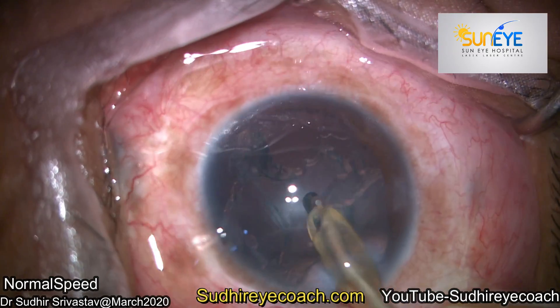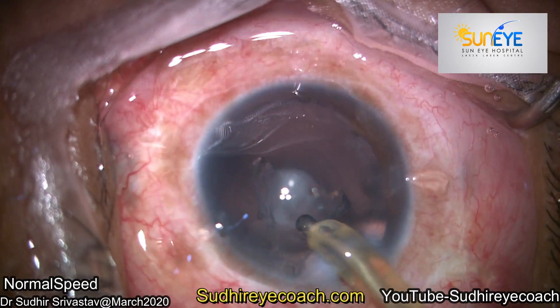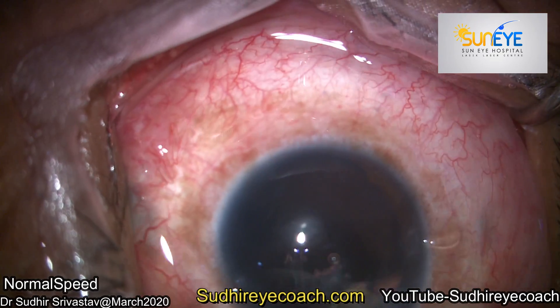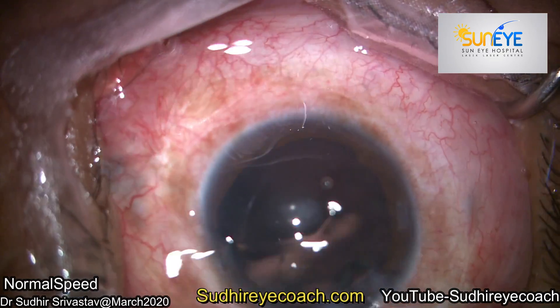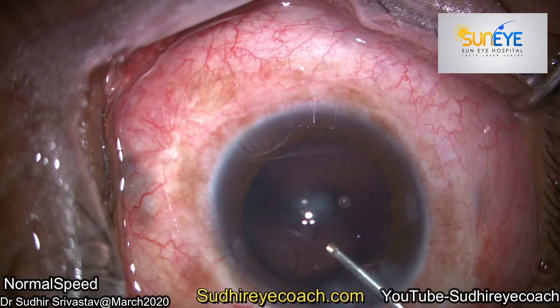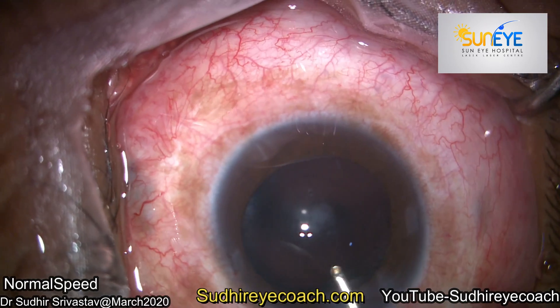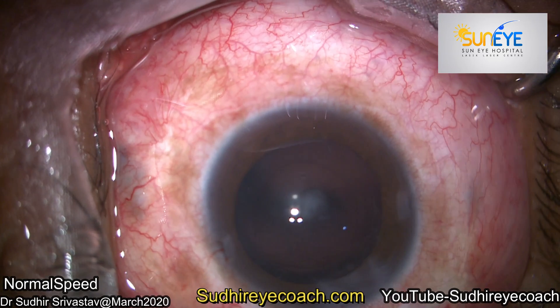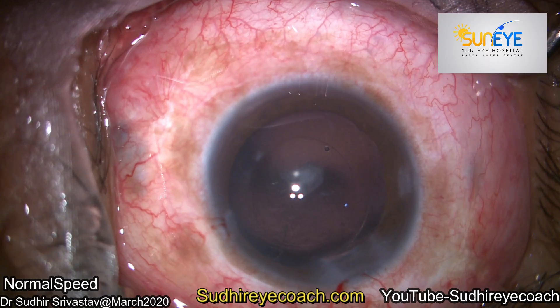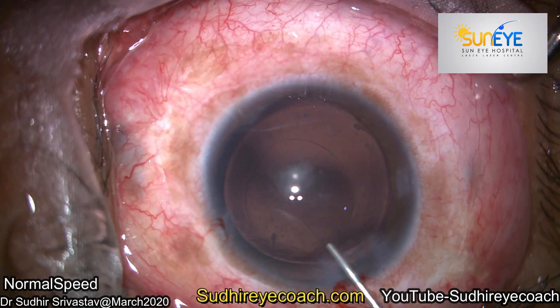As I cleared the cortical matter, I realized some opacification in the central visual axis. Initially it looked like some fibrotic plaque was present on the posterior capsule in the center. Normally whenever I get any opacification on the posterior capsule, I always try to polish it with the help of a hydrojet or a polisher.